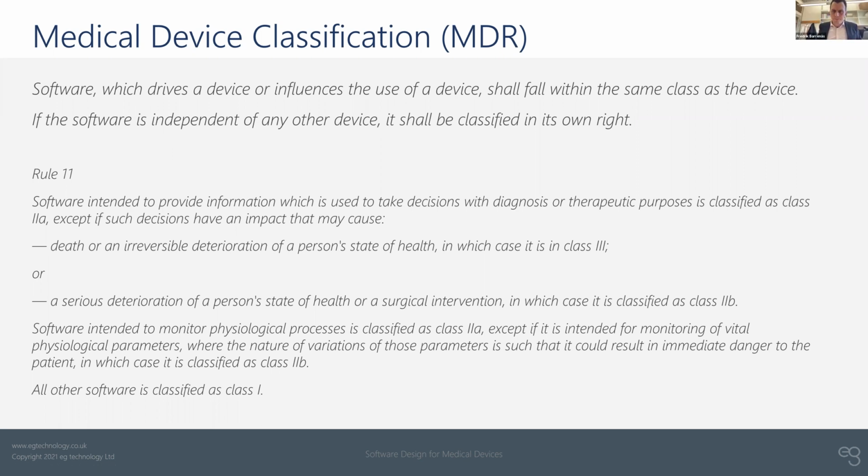Yes, can you hear me? Yes. Yep, great. So you mentioned the focus on continual follow-up on performance to ensure that quality is maintained over time. Now, many of us are in the machine learning AI space. We would expect our performance to improve over time. Is there any wording, or do you think there will be wording in the regulations, about how to follow up the expected improvement of performance in the device?